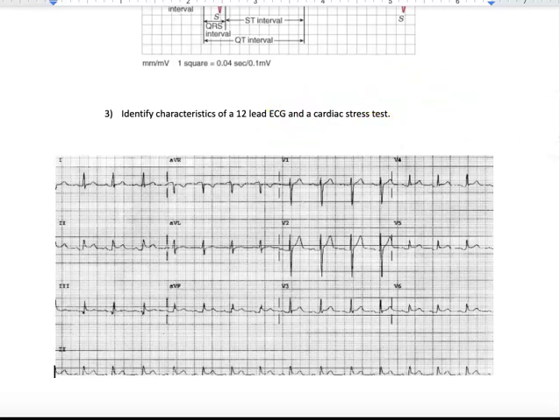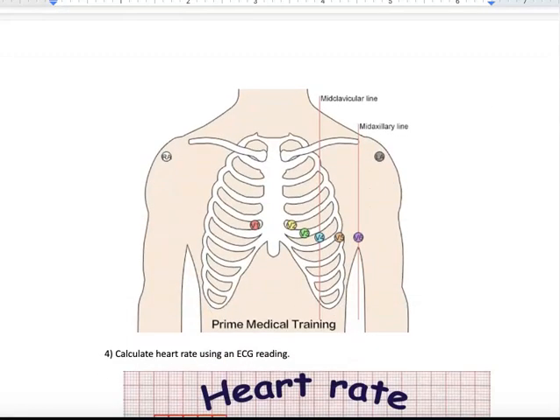So when they set this up, what they will do, just to give you a basic overview, is they will put several electrodes on you. These 6 right here go in specific spots between your rib cages. You don't have to know them, but you have 6 right here. Okay, and this actually is on the side. And then you have 4, 2 up here, and then 2 down below here that they're not showing you. So you have a total of 10 electrodes.